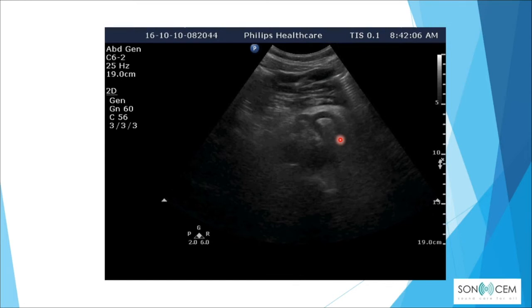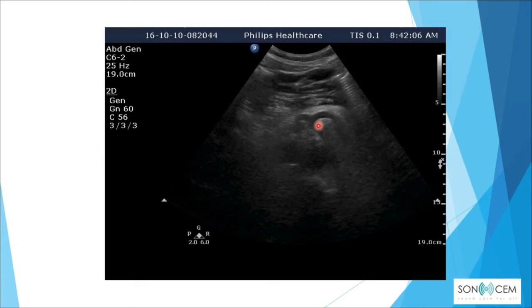We may need to angle the probe slightly to get this view. The image will often be obscured by bowel gas shadow. Two tips to get a clearer view and reduce bowel gas interference: first, apply gentle and constant pressure for around 10 to 30 seconds until a good view of the aorta and IVC is obtained; second, ask the patient to lift their knees to relax the abdominal muscles, which allows better probe pressure and indirectly displaces bowel gas.